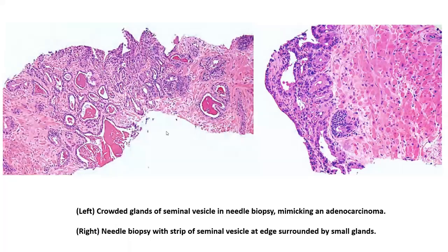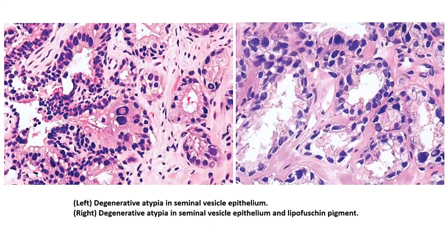Like I said, this seminal vesicle tissue is not going to be an issue for you in the case of radical prostatectomy, obviously, because at the time of grossing, you know which level the sections you have submitted come from. But the problem is going to arise in a true cut biopsy, wherein this crowded proliferation of glands could sometimes be mistakenly diagnosed as an acinar adenocarcinoma. Keep those two important points in mind when you approach such cases. The pleomorphism and the pigment within the cytoplasm should act as diagnostic clues to avoid the pitfall of calling seminal vesicle tissue an acinar adenocarcinoma.